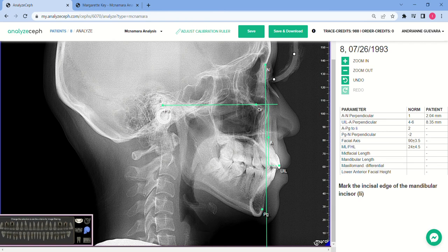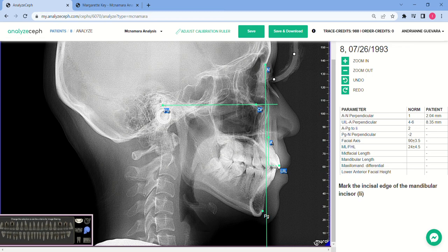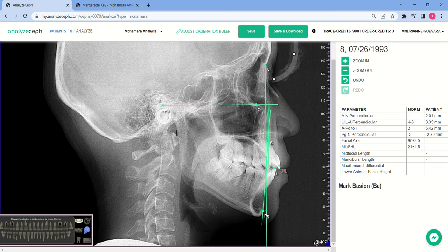If you need to make a correction, you can just drag the plotted point to the desired location, or you can click undo. Next, mark the incisor edge of the mandibular incisor.